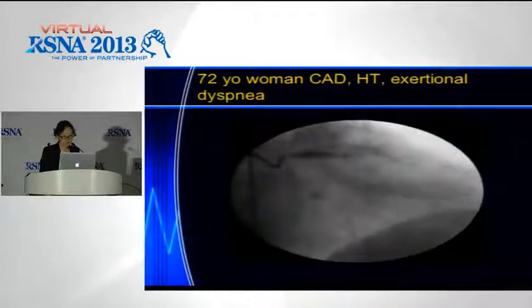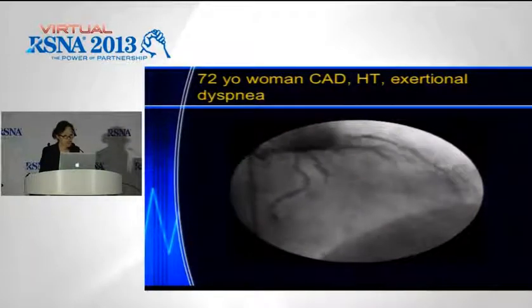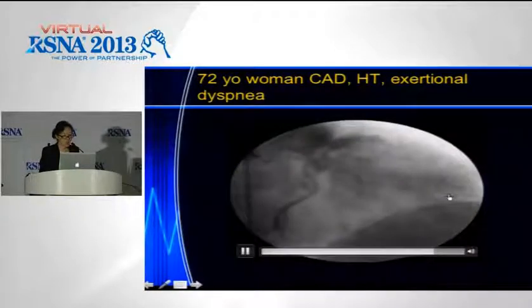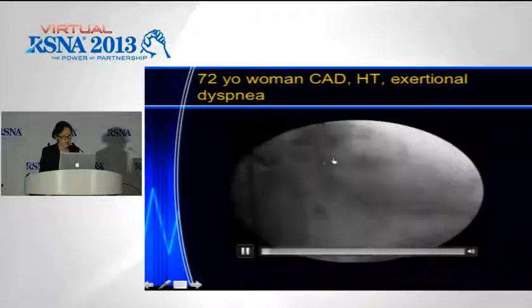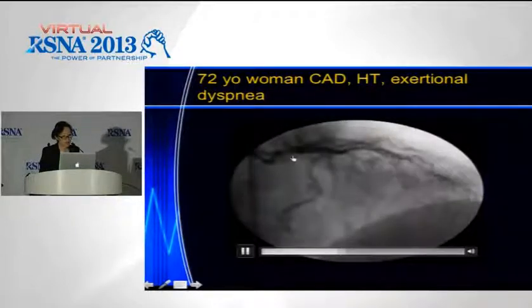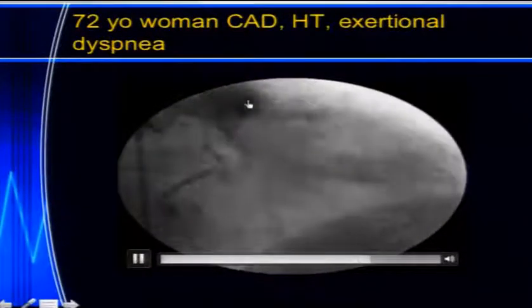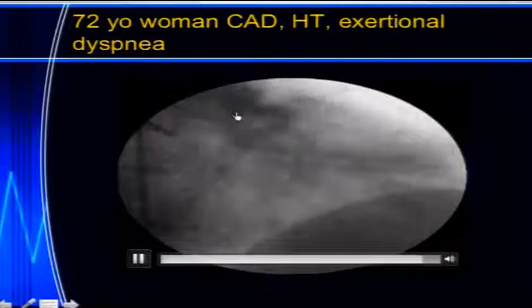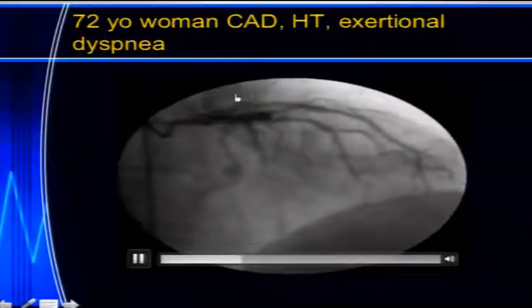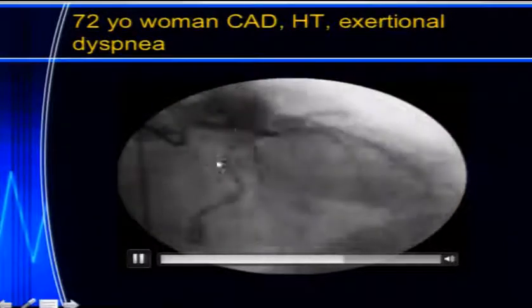It's an interesting lesion that came to light on catheter angiography. So this patient had a known history of coronary artery disease, and obviously they were concerned about coronary artery stenosis. But if we look at this video from a catheter angiogram injecting the left coronary system, we can see this abnormal mass here at the top of the screen. This first appears during the arterial phase, and it persists through into the venous phase, and we'll just see it coming through again shortly. Fairly well circumscribed.